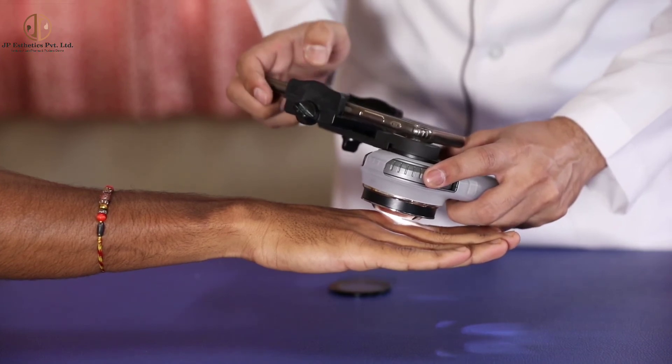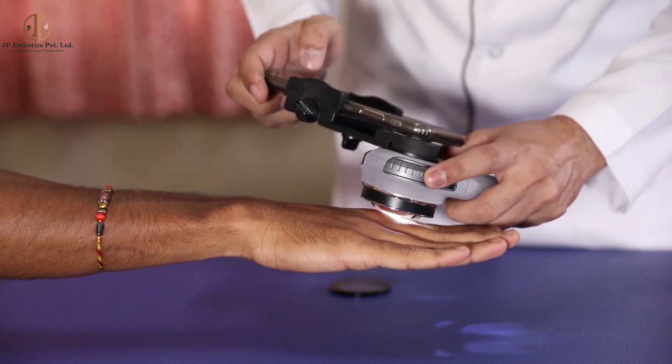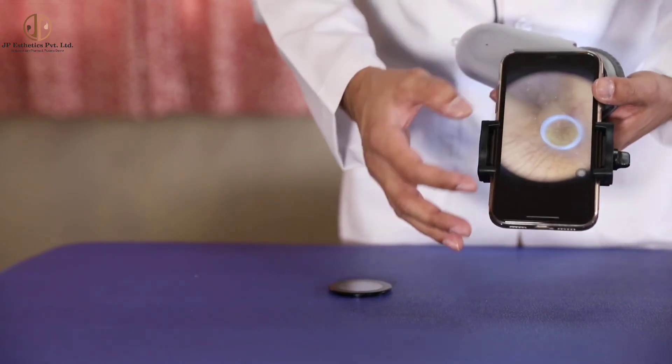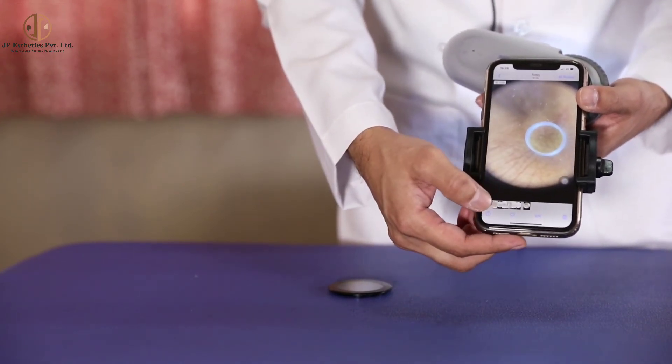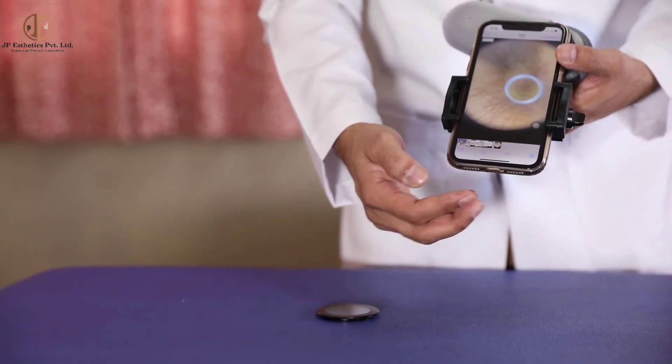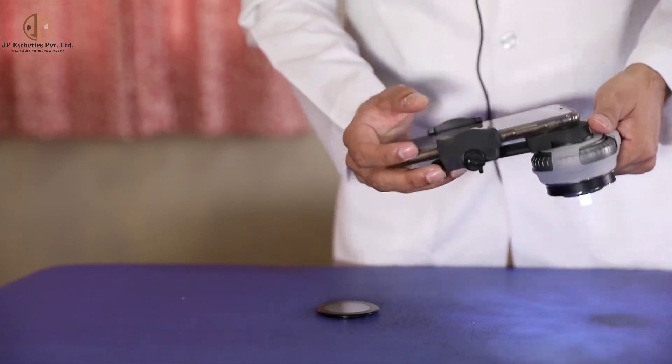I am keeping the probe into the web space. The web space image will look like this. This Illuco dermatoscope has a small probe for visualization of inaccessible areas like the web space.